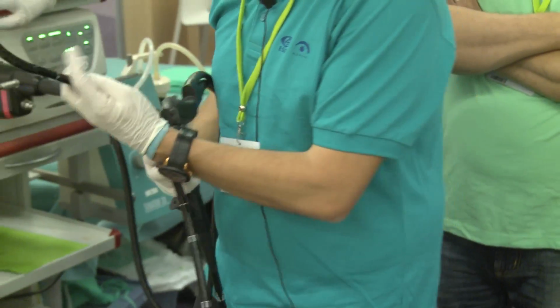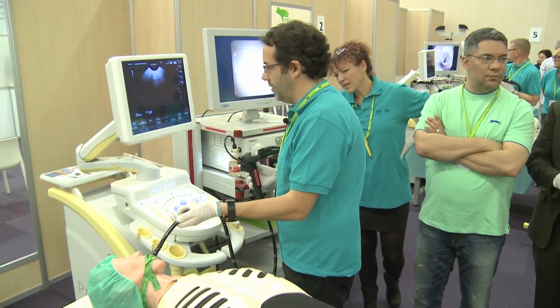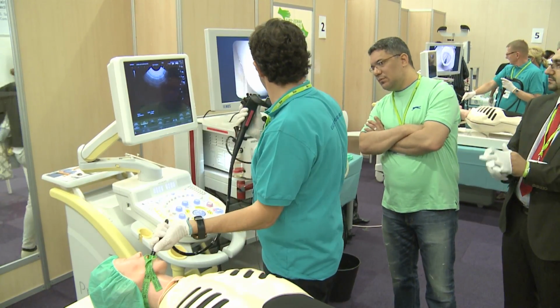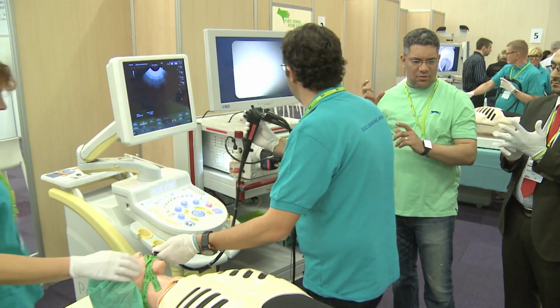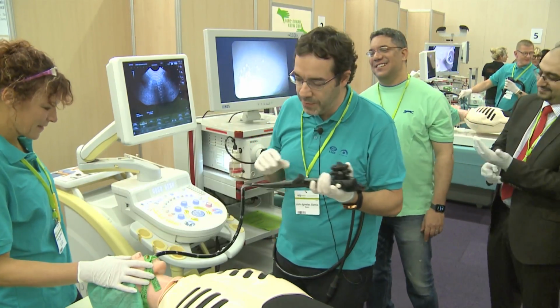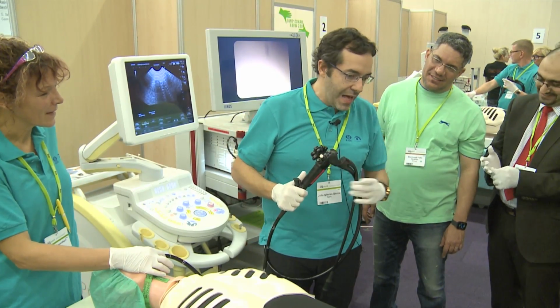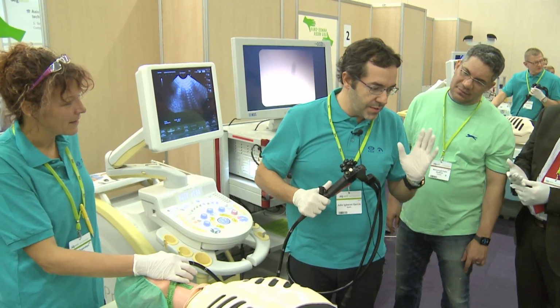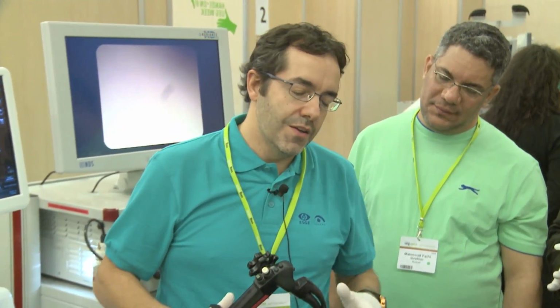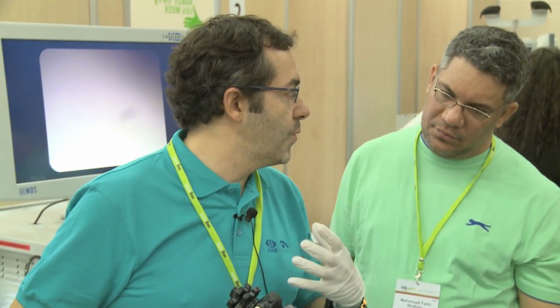And let's begin. Okay. Well, this is how I'm intubating, with the left hand. I'm not left-handed, but I always intubate with this hand. Okay, I will explain why. Well, he's one of my trainees, so he already knows that I intubate with the left hand. Another very important part of EUS is that you need to have the patient very comfortable, and to have him comfortable you need to start from the very beginning. So the reason for intubating with the left hand is the position of the scope. I always want to see in the mouth where I'm going.